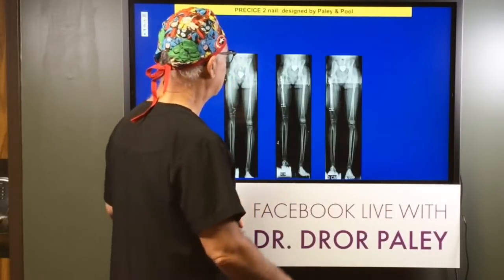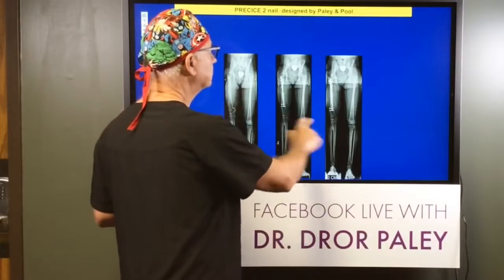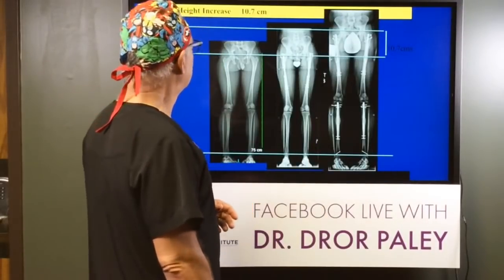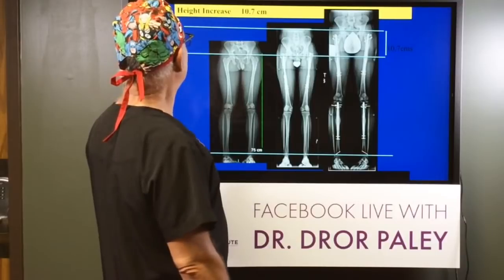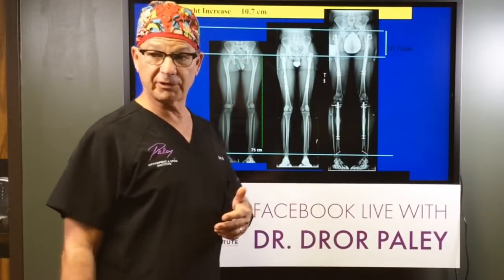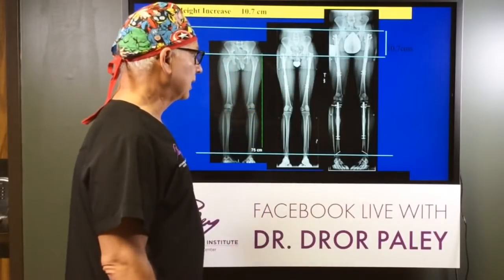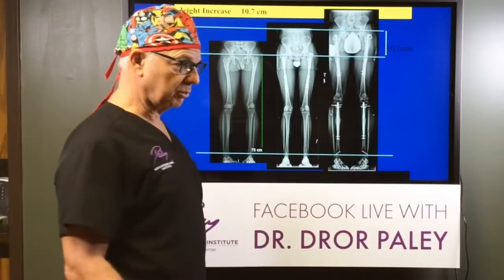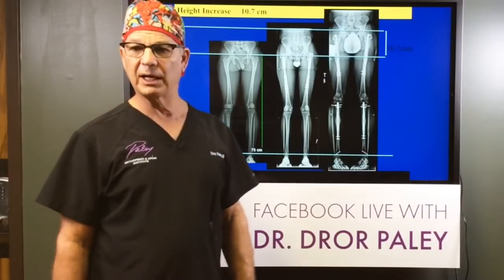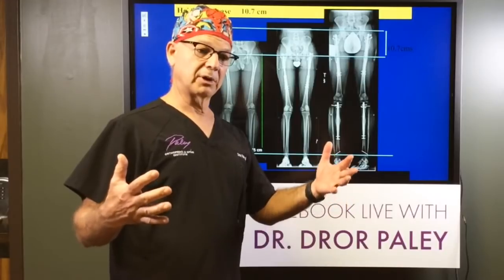Going back in time a little bit, one of the things we did with these implants was lengthen patients with dwarfism. We started with external fixators. And our protocol, which is different than everyone else's, even different than the Ilizarov's, was to lengthen both tibias, both femurs at the same time, and to do it 2 or 3 times during the lifetime, and 1 time to do the arms. So you can see here's a patient, here's the monolateral fixator, that's the Orthofix device.